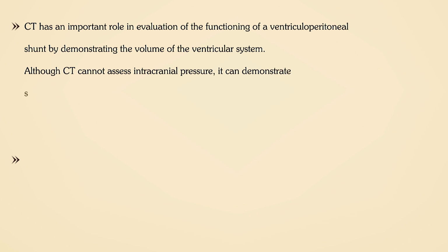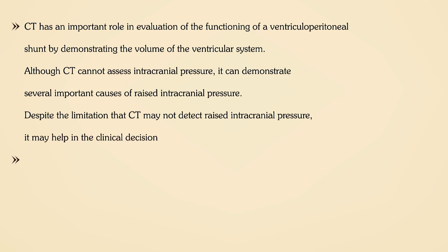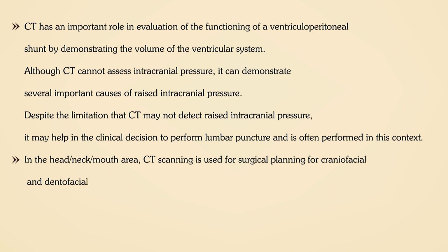Although CT cannot assess intracranial pressure, it can demonstrate several important causes of raised intracranial pressure. Despite the limitation that CT may not detect raised intracranial pressure, it may help in the clinical decision to perform lumbar puncture and is often performed in this context.